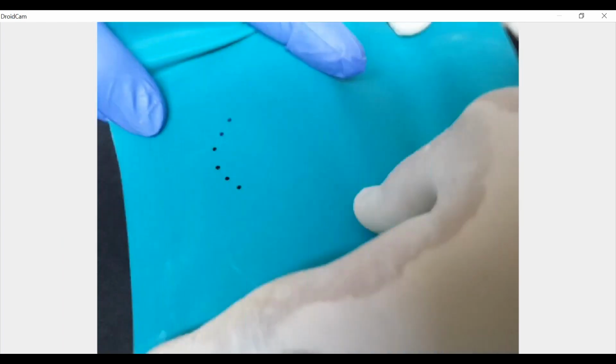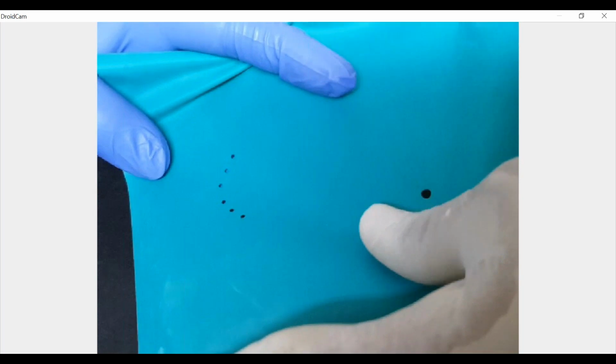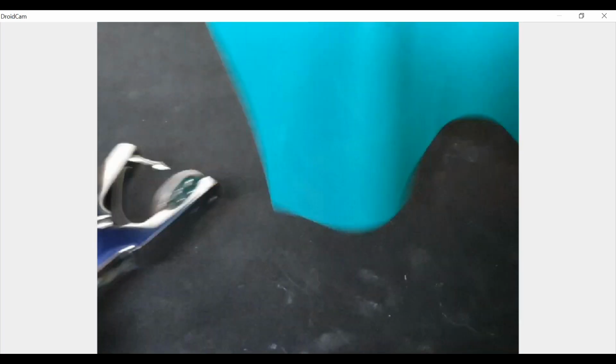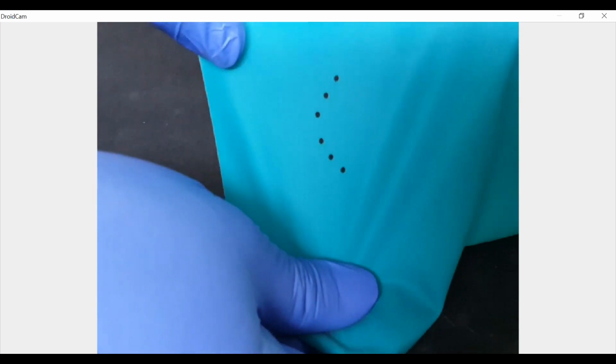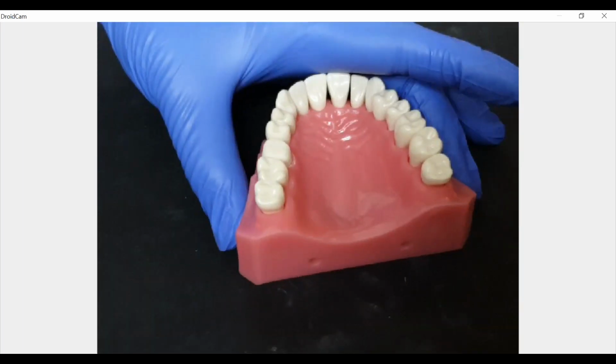So we have a clean and neat punch here. Can you see that? There aren't any remnants anywhere, nothing at all, absolutely clean. That's the quality of the sheet also, which matters, which is responsible for that.